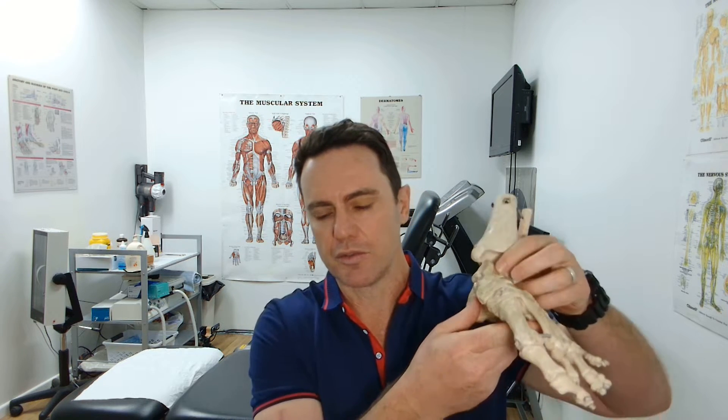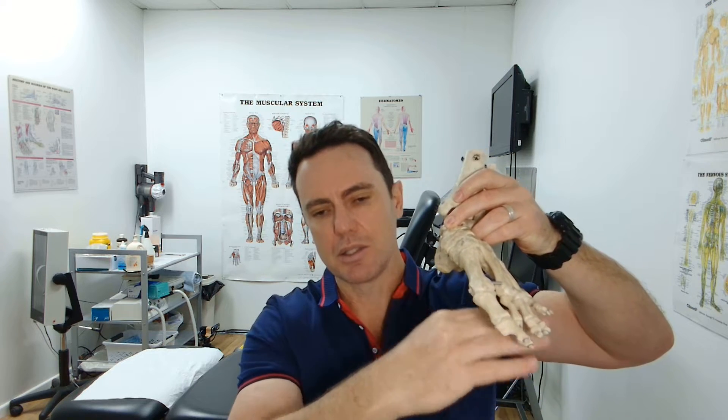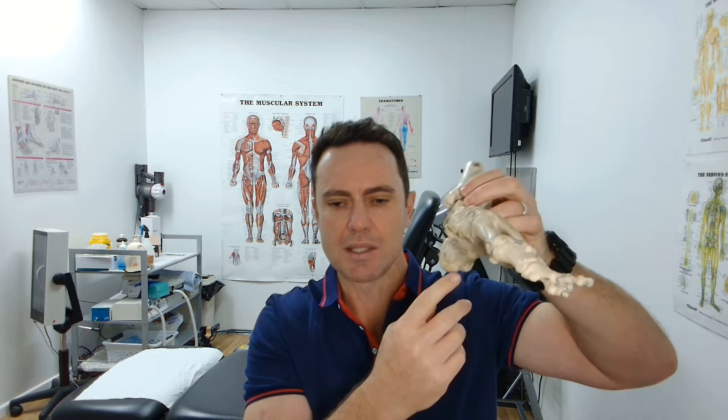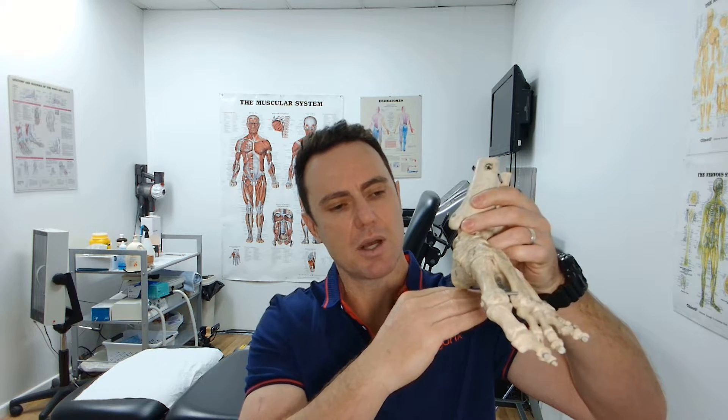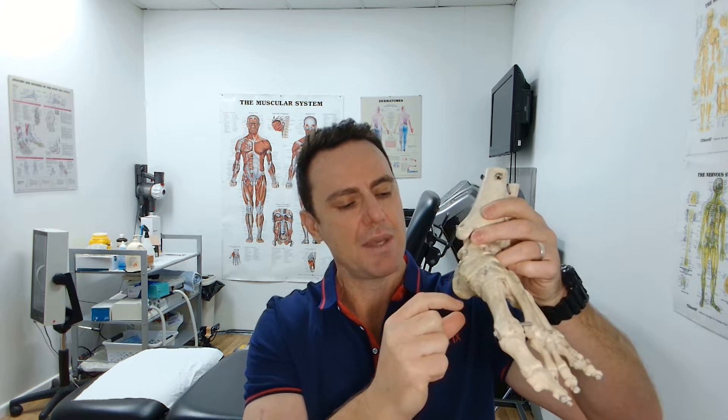Orthotics for plantar fat pad atrophy — what do we do when the fat pad wears out on the bottom of our feet? It's a common problem that as we age, the fatty pad or the cushioning section on our foot wears down. If we overlay the skin, muscles, ligaments and everything on the foot, in the forefoot and the rear foot and across the whole plantar surface, there's quite a thick fatty pad whose function is to cushion the foot. It can be up to one to two centimeters thick.